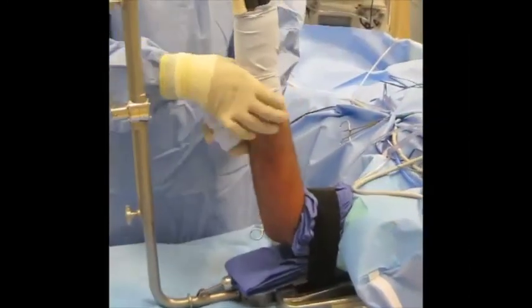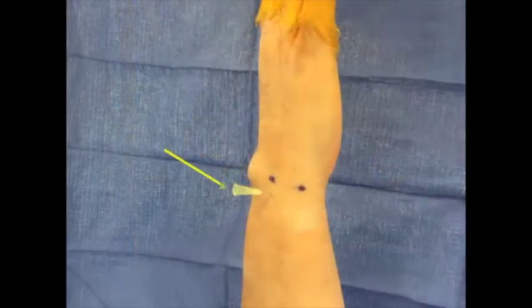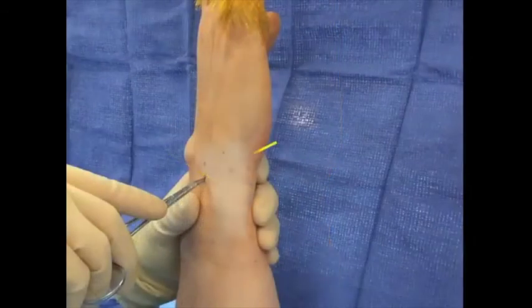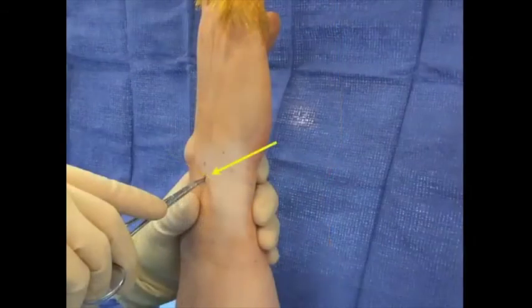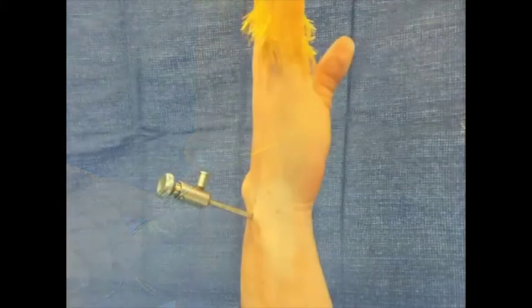All ports are created by inserting a 22-gauge finder needle prior to making an incision with a 15-blade through the skin. The skin incision is then followed by spreading in an axial direction with a mosquito in line with the tendons until entry is made into the joint. The mosquito is then turned 90 degrees and spread in a horizontal fashion in line with the joint to avoid injury to the articular surfaces of the carpus.